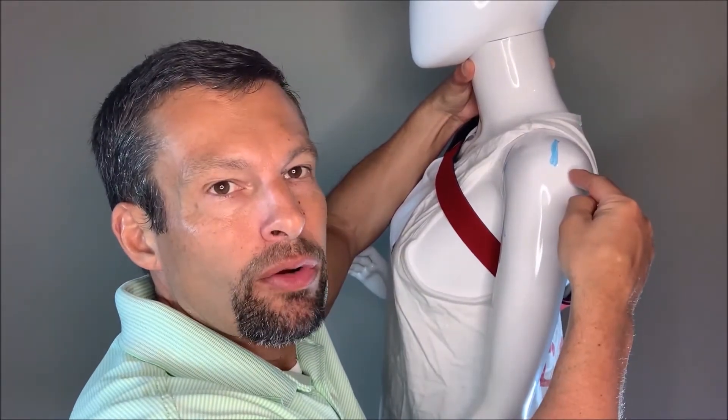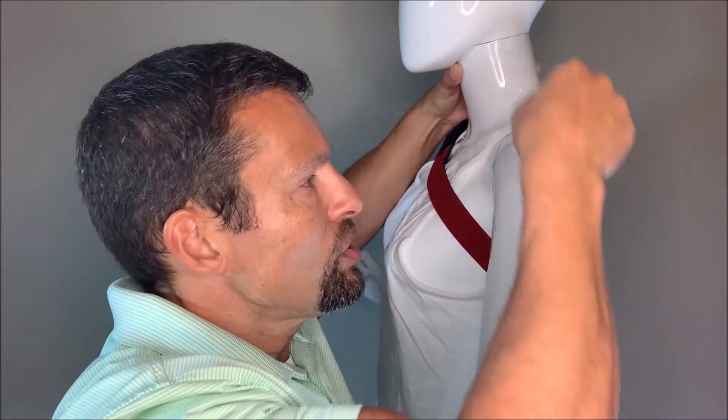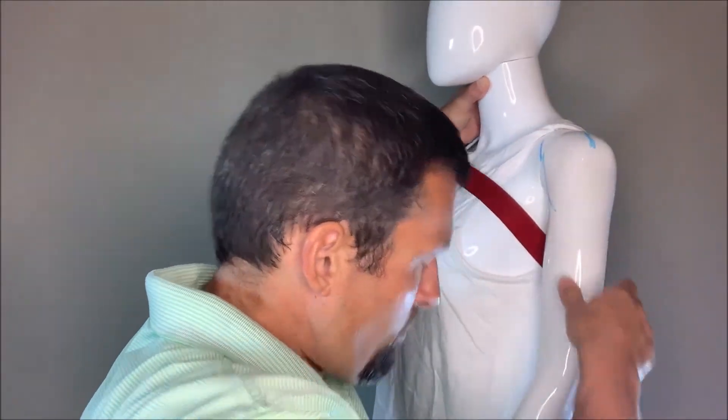Some people may do an arthroscopic evaluation through those little poke holes to look at what's going on in the shoulder, and then do a mini open repair. There are different reasons why you might do a mini open — most often because that's what you're most comfortable doing. A mini open is an incision on the lateral aspect of the shoulder, usually four or five centimeters in length. You go through the deltoid muscle to get to the rotator cuff and repair it there. Typically people who do this are of an older generation who feel more comfortable doing the procedure open versus arthroscopically.